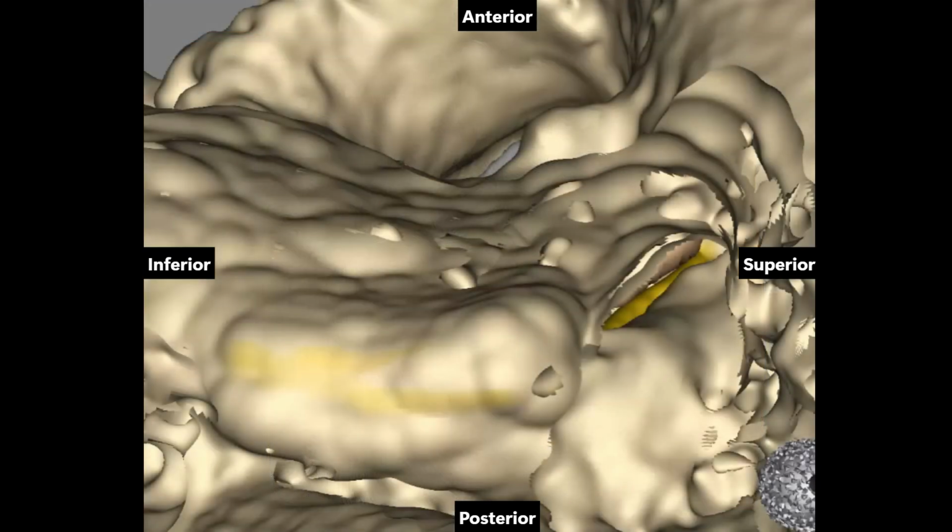The boundaries of the posterior tympanotomy are the mastoid facial nerve trunk medially, the chorda tympani nerve laterally, and the incus buttress superiorly, which is a buttress of bone left behind to preserve the incus's attachment in the fossa incudis.